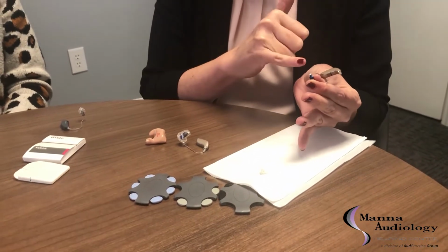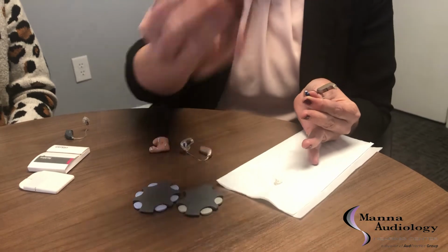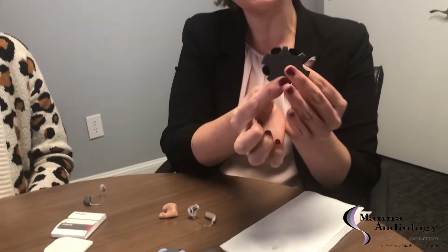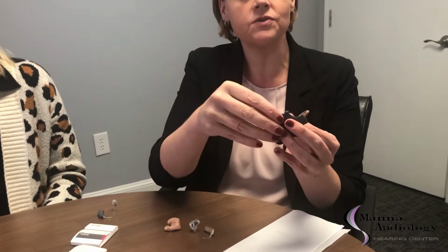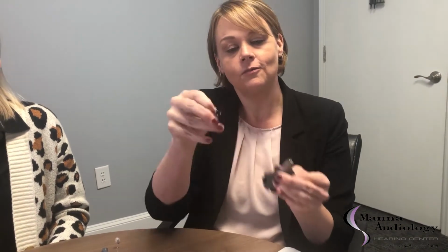So for this particular type of filter, you're gonna have a disc that has little black tabs. So to remove, the first thing I wanna do is of course remove one of these guys from here. On this guy, you have a removal tool on one side and you have the replacement on the other. So very simply, you're gonna take this, you're gonna snap it right into place. You don't have to twist it, you don't have to force it. It's just a little pressure fit.